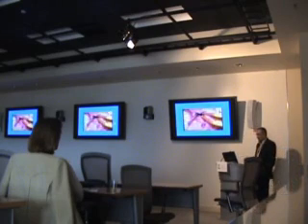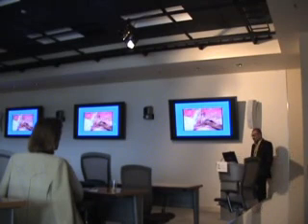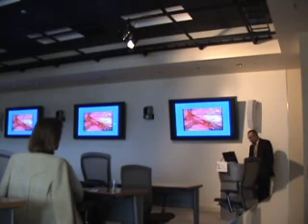Dissecting the arachnoid, exposing the MCA branches, there are the lenticulostriate branches, and continue opening the arachnoid. Just here to show you the live filling of the arteries.